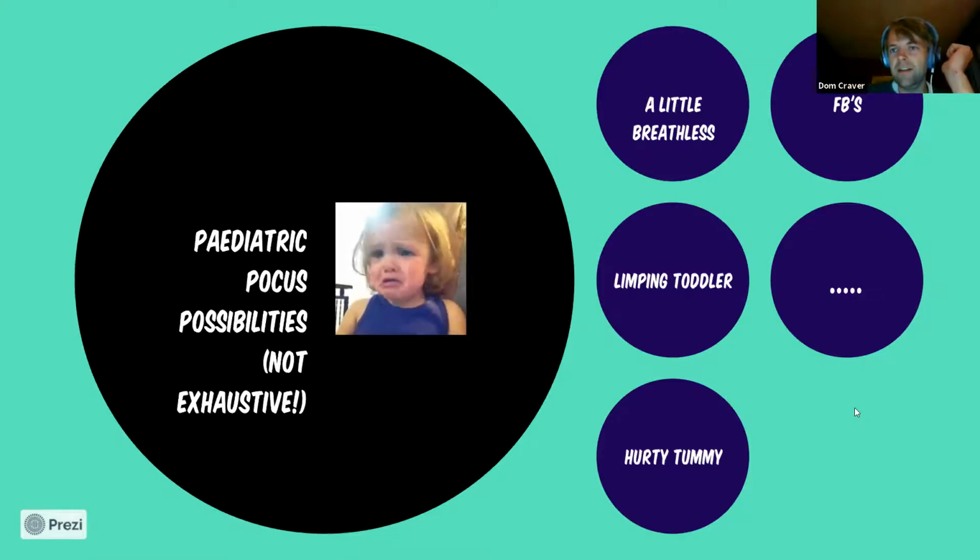Yep. Okay, good. So we're making some pretty good progress here actually. So I'll try to slow down a bit.